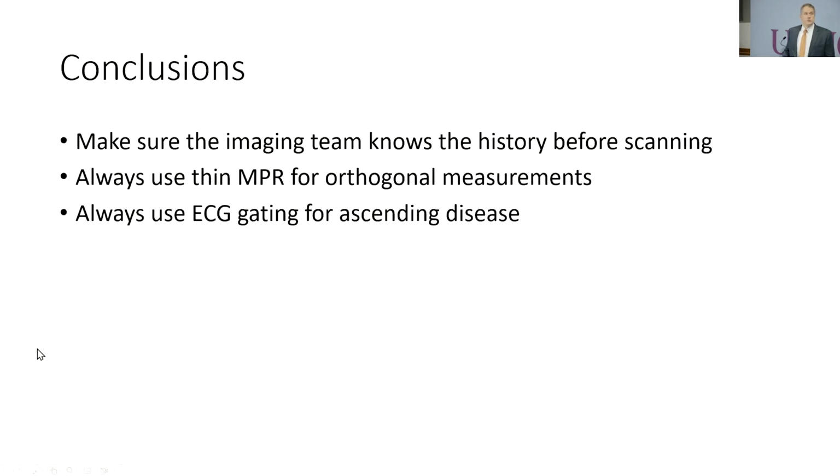And in conclusion, I just wanted to reemphasize, make sure that the imaging team knows the history before scanning, use MPRs for orthogonal measurements always in follow-up, and use ECG gating whenever possible for ascending disease.